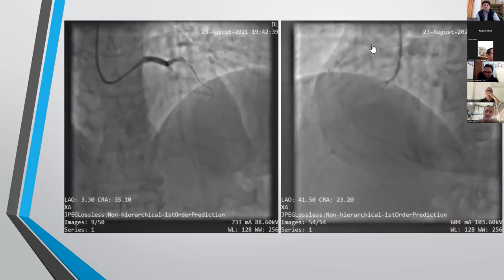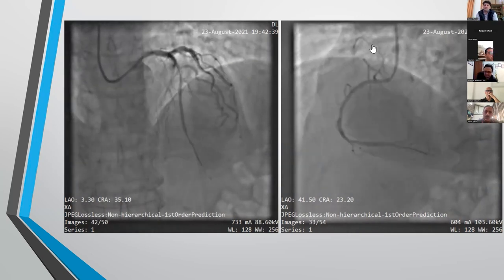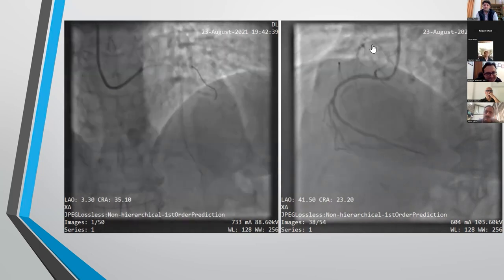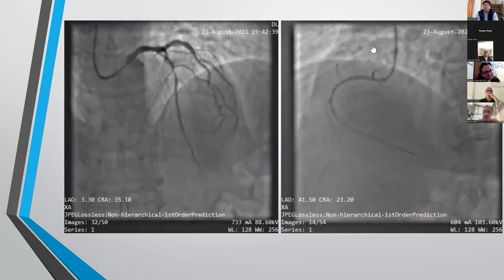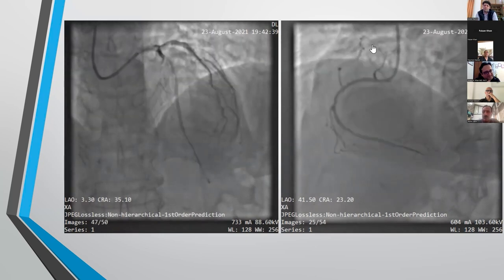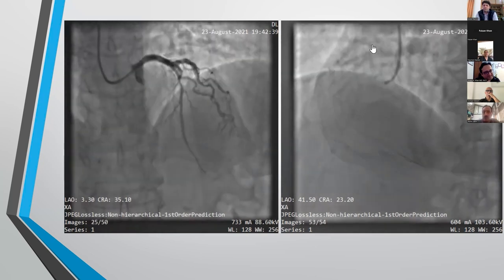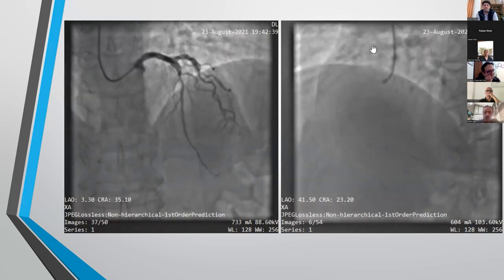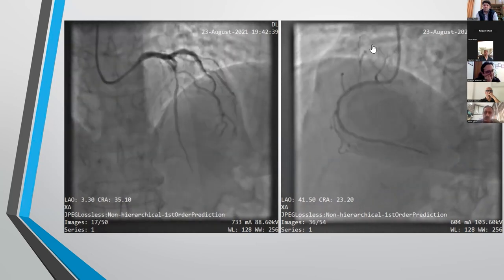You should understand the basic physiology of the waveforms and all that drift, and make sure that your guide is outside the left main when you are doing the left main FFR, IFR, and you are doing equalization when your guide is outside the left main. Those kinds of things are going to be very, very important, and you really need to understand. I'm sure probably we're going to discuss those things in the talk coming up.